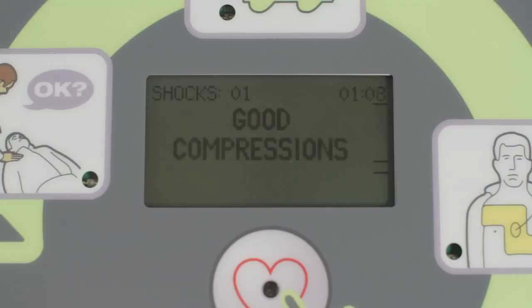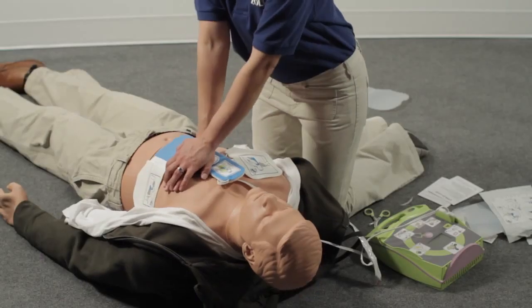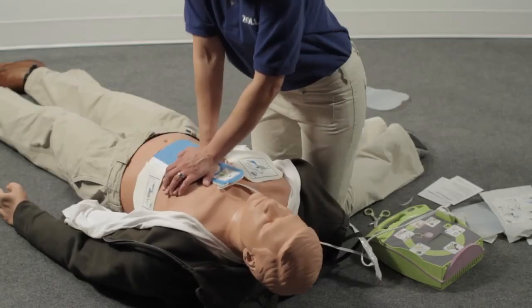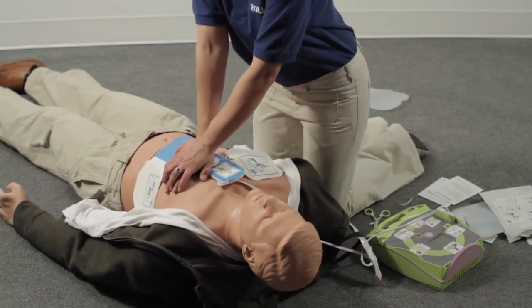The AED Plus will also give you a real-time display of each chest compression on the bar gauge. The upper line represents 2 inches, while the lower line represents 2½ inches. Each compression should be deep enough to at least touch the upper line. After giving 30 compressions, you should give 2 rescue breaths. Repeat this cycle of 30 compressions followed by 2 rescue breaths until the AED Plus tells you to stop CPR.